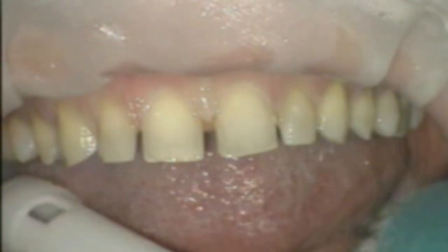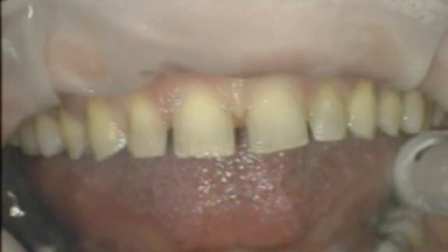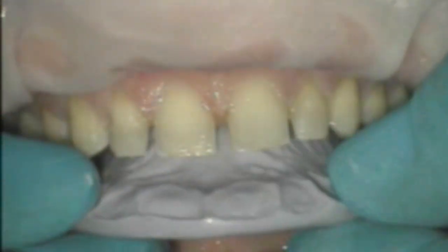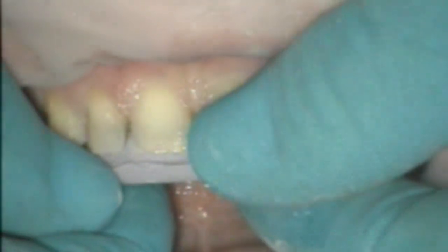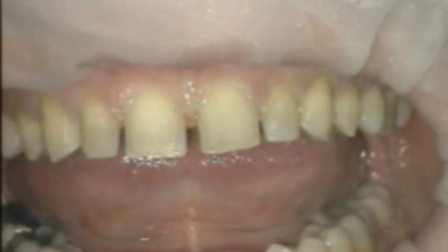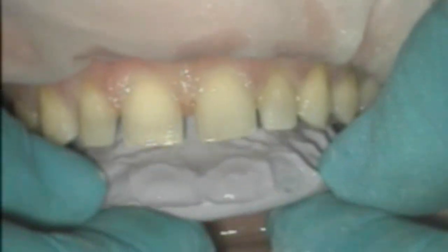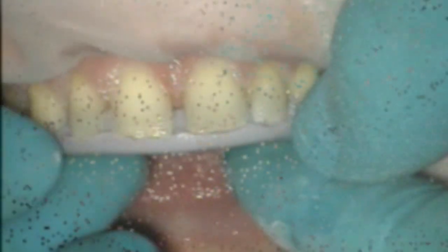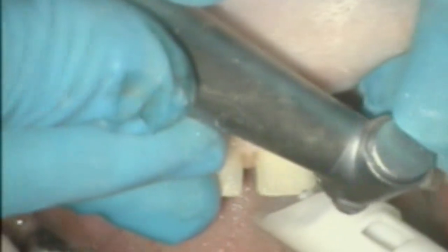And again, getting in there, getting everything out, rinsing it really good. You see I'm going in there with a full swoop. If you're using a retracted device or any type of retractor, going up underneath there, just getting rid of any tooth dust fast, right? Because he doesn't have a handpiece. He went out. Now he's checking some other things. And I want to make sure I'm getting in and out, rinsing quickly. Again, nothing is in the way. Keeping everything nice and dry. There's a little pool of saliva back there. And I may, at this point, since he's checking reduction or things like that, get in there with a quick saliva ejector. But again, look at where I am.